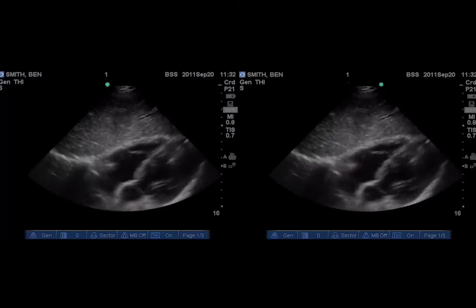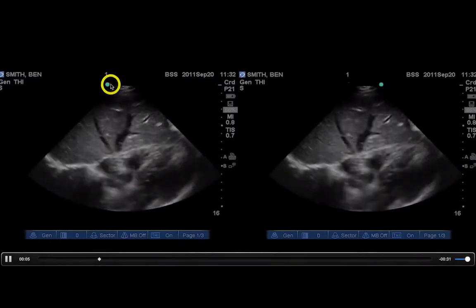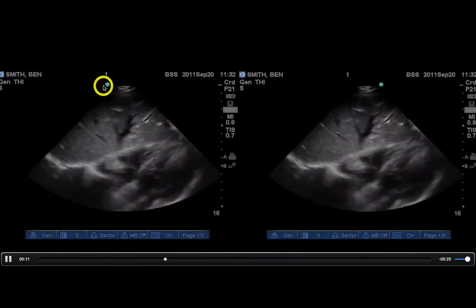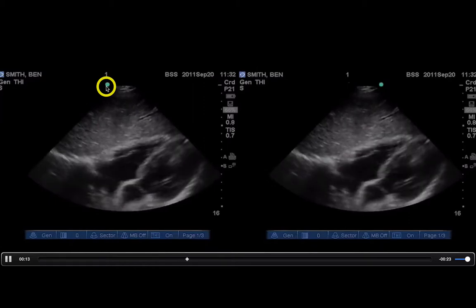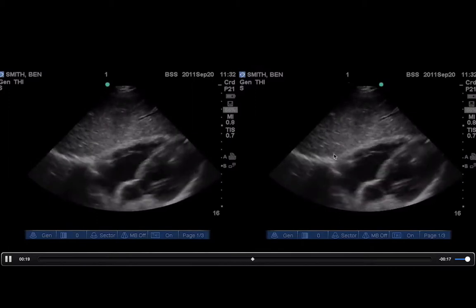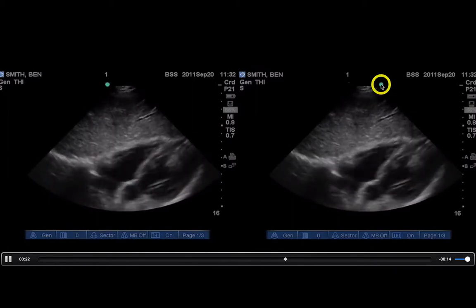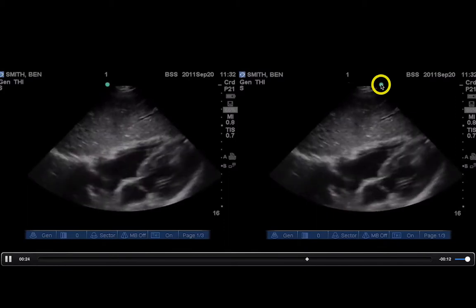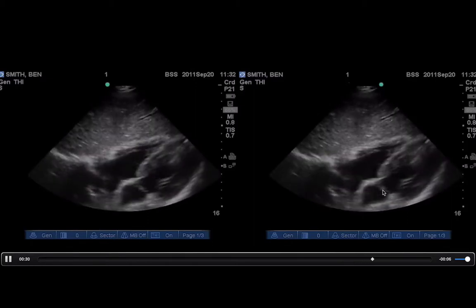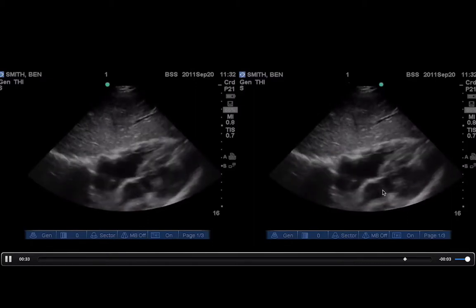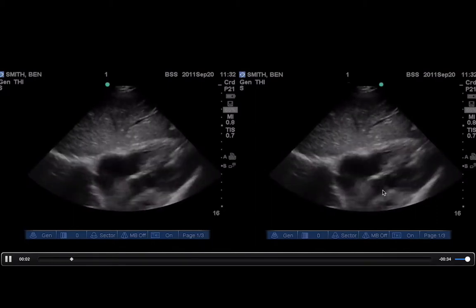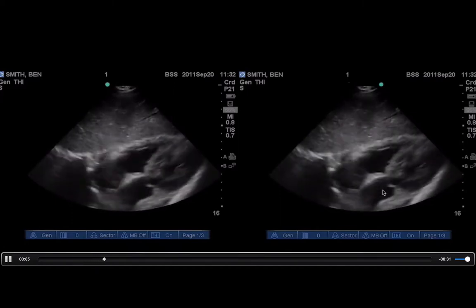For most emergency department ultrasound applications, you're going to see the probe marker on the left side of the screen. With the probe marker on the left side, on the apical four-chamber view your probe marker goes towards the right, and on the parasternal long axis your probe marker goes to the left hip. But if you have it set up like cardiologists do, that probe marker will be on the opposite side. To get the image to look the same, you just have your probe marker flipped 180 degrees. So with cardiology settings, the probe marker on the apical four-chamber goes towards the patient's left, and on the parasternal long axis it goes towards the right shoulder.